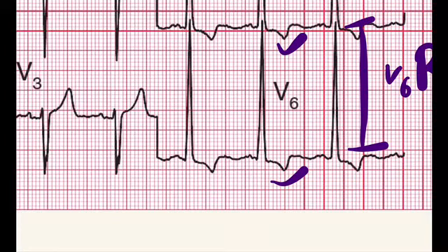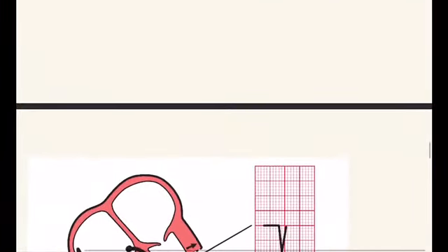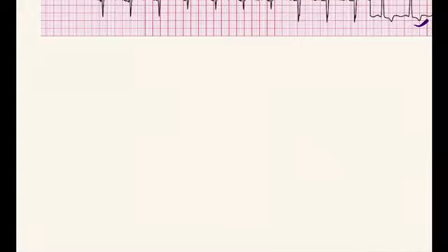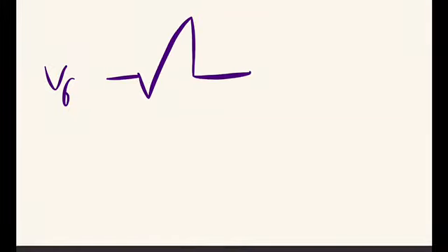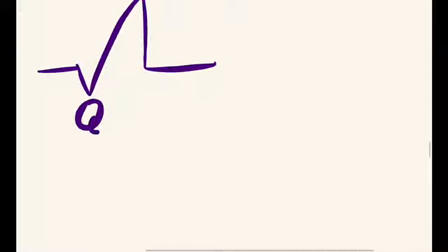now the very important part of this video is the Q wave, and how this Q wave has significance in myocardial infarction. So friends, normally why do we get a Q wave? This is the V6 lead. Okay, normally this is the normal ECG obtained from lead V6. Now this Q wave is because of septal depolarization.